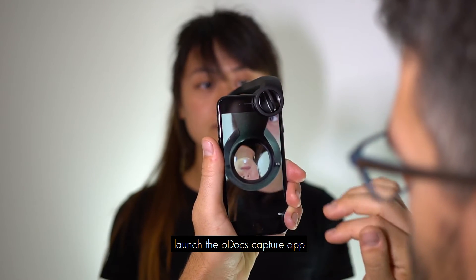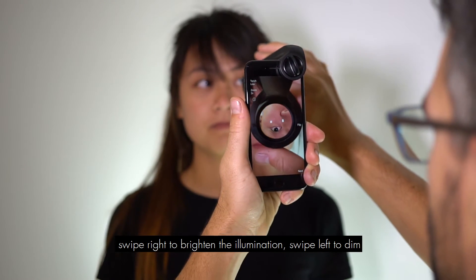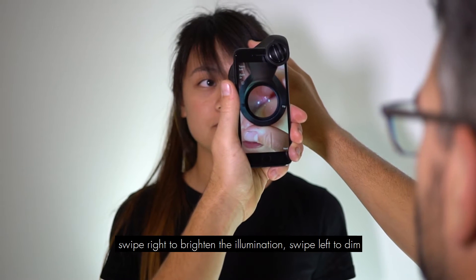Launch the oDocs Capture app. Swipe right to brighten the illumination, swipe left to dim.